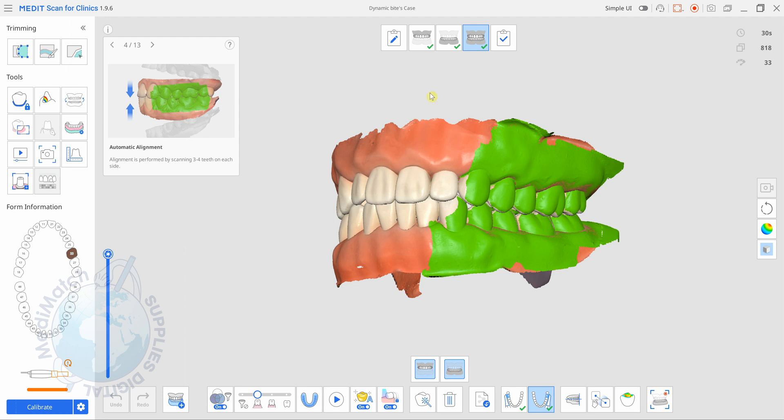Hi everyone, it's Dave from Medimatch. Hope you're doing well. In this video I'm going to show you how to use the mandibular movement tool in MeditScan for Clinics.